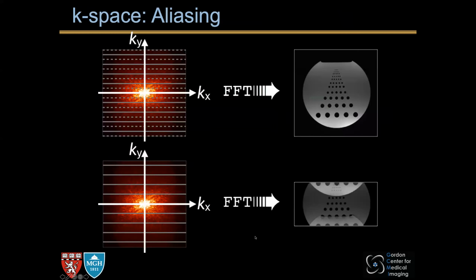Now we talk about K-space a lot, and we talk about different sampling trajectories in the K-space. But what is a K-space? What is the property of the K-space? Well, let's take some quick examples to have a sense. The K-space, again, is basically the Fourier transform domain of the image object. And our data, MR raw data, is sampled in the K-space as discrete points. So very quickly, we can imagine we have two issues when we're talking about how to sample the K-space.